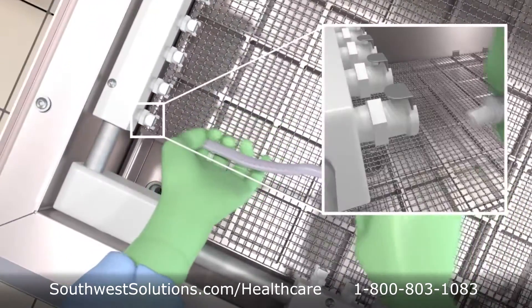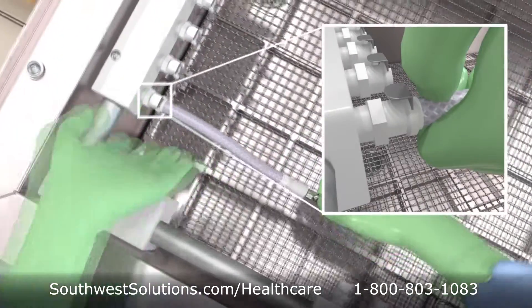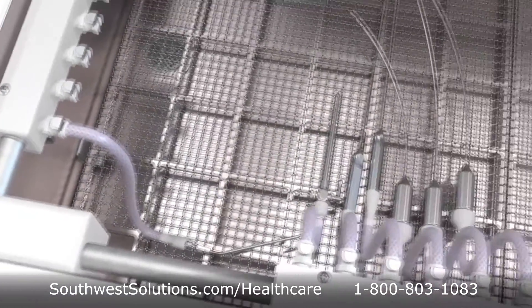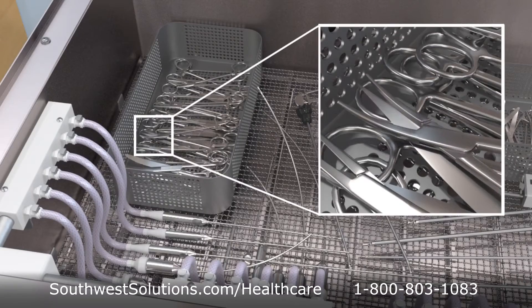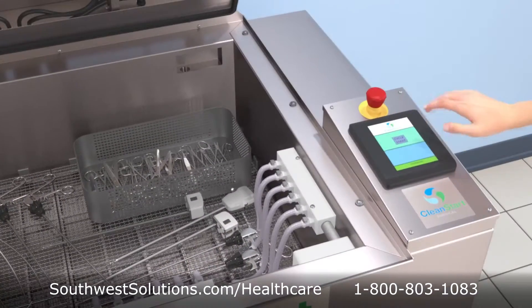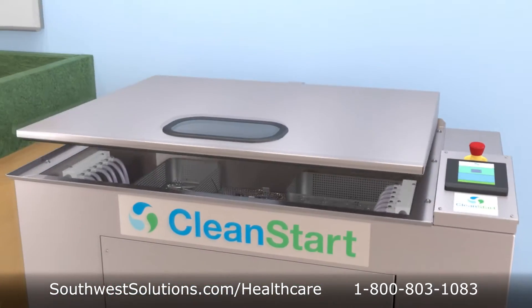Each cannulated instrument is attached to one of 24 specialized ports. Non-cannulated instruments can be placed freely in the trays in the open position. With the push of a button, the fully automated wash sequence begins.